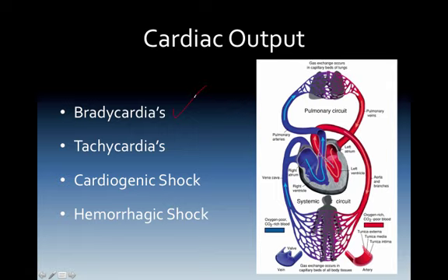In tachycardias, consider an SVT or VTAC with a normal end-tidal CO2. This would suggest that the patient is tolerating the tachycardia okay. But in the normotensive patient, if the end-tidal CO2 is decreasing, it states poor perfusion. So we could actually see them going into an unstable tachycardia kind of coming.